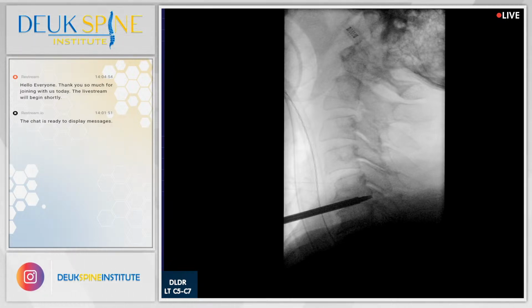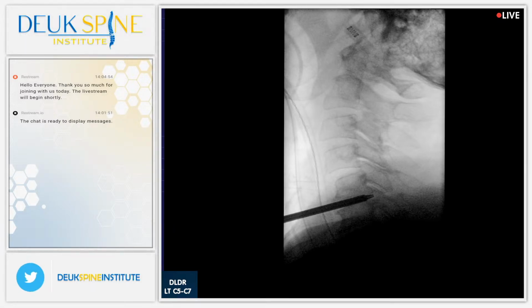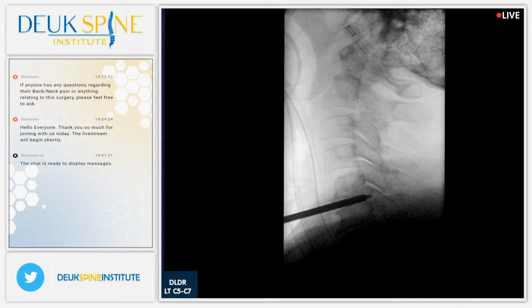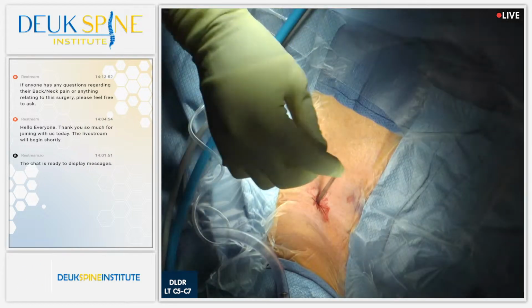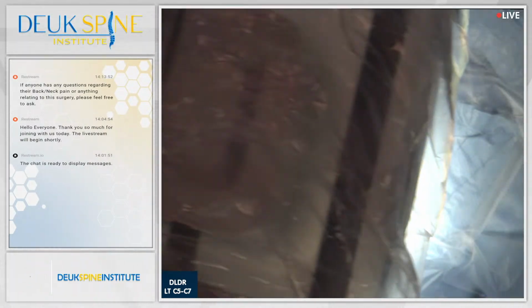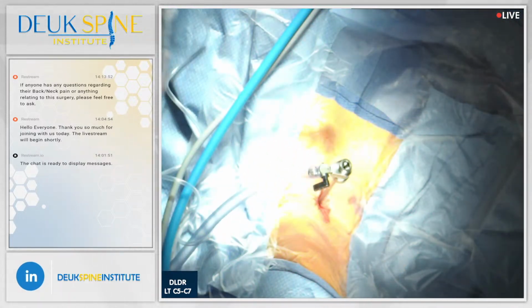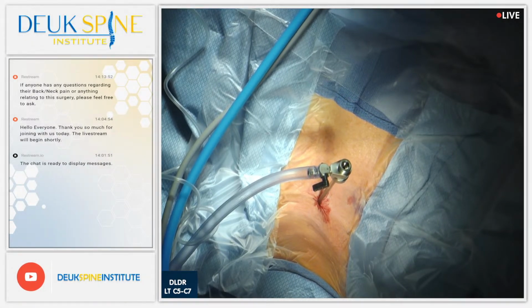All right, she is asleep under general anesthesia. So far, looking good. Almost done. I think that's about it. Maybe one more tap for good measure. I think that looks great. Now she does have the little beak. We're going to get rid of some of that bone spur, but not all of it. That's for sure. Our goal really is primarily to remove herniated disc, soft stuff, because what's pressing on her nerves and spinal cord are a combination of hard and soft. We can get rid of the soft stuff easier than the hard stuff.